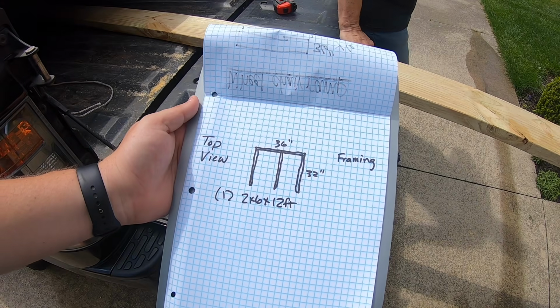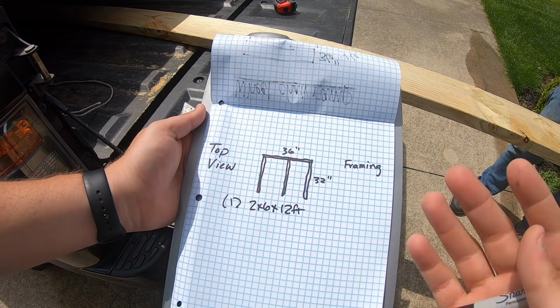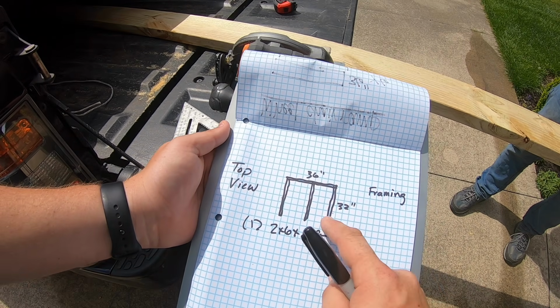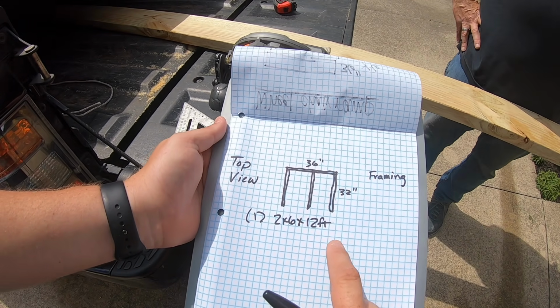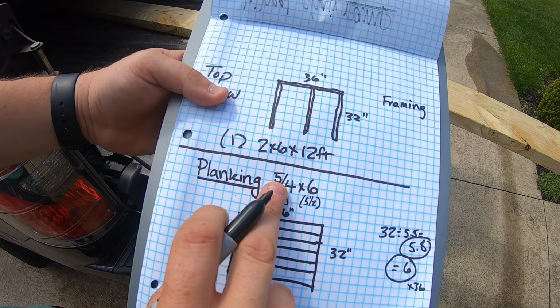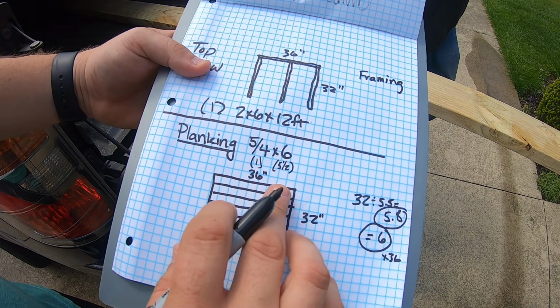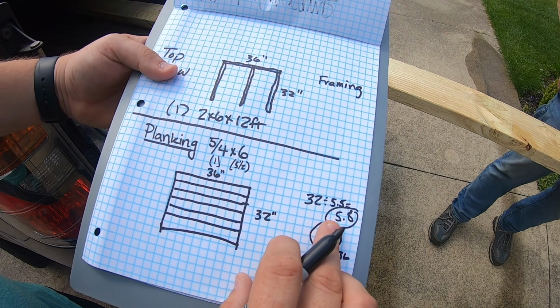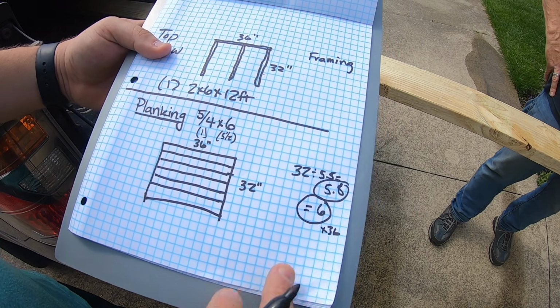Now that we've decided what we want to do with the frame, remember it's 36 by 32. We want to figure out exactly what we need. Depending on what you choose on your size can really determine what that looks like. So that's 3 foot, 6 foot, 9 foot, 12 foot. So we will need one 2 by 6 by 12. To determine the planking, we're going to go ahead and measure it out. It is 5/4 by 6, which is really about 1 inch by 5.5. And remember, we want 36 inches long, and we have to have 32 inches worth of it. So it's 32 divided by 5.5, which is 5.8. You can't buy 5.8 boards, so you round up to 6, and you want those 36 inches each.